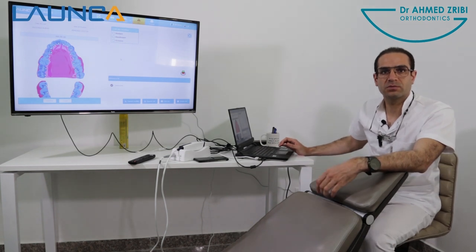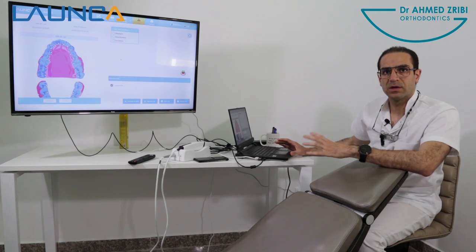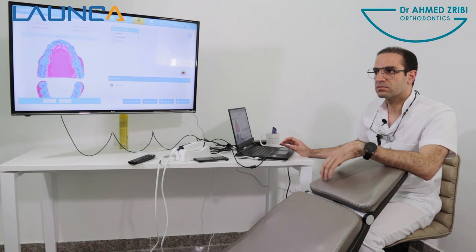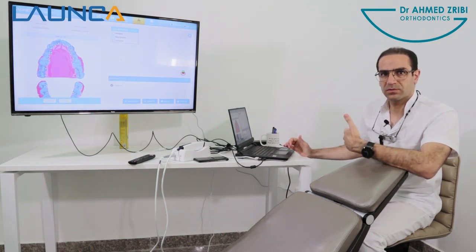When you want to send the scan to the laboratory you just need to generate a code. It's going to upload the whole scan to the cloud and send a downloading link to your laboratory.